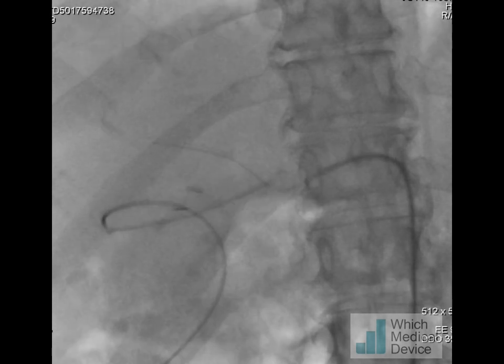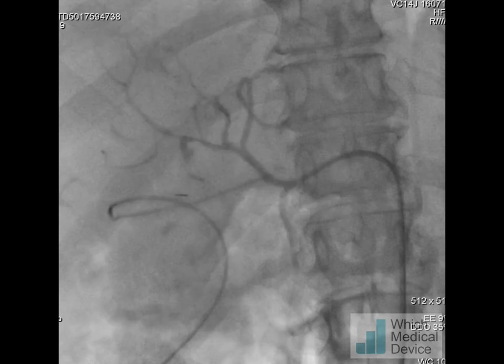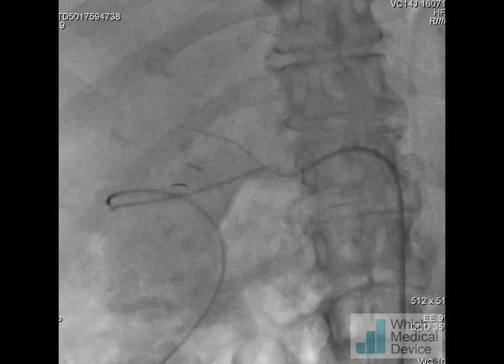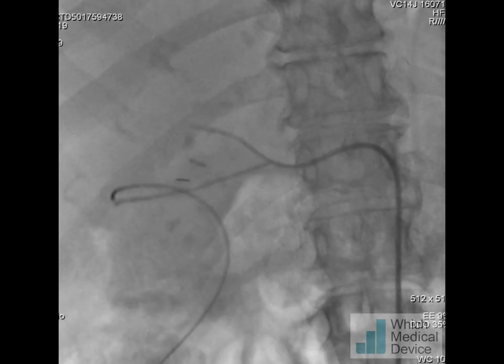Here the sheath is in place. I'm then going to withdraw the central stiffener, and I obviously have to get a supportive wire more distally, as the tip of the wire is just across the pseudoaneurysm neck as you can see when we've injected some contrast here.